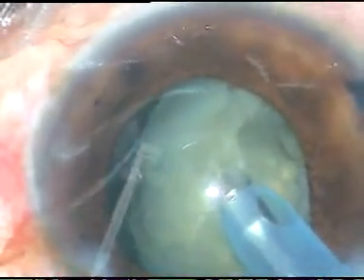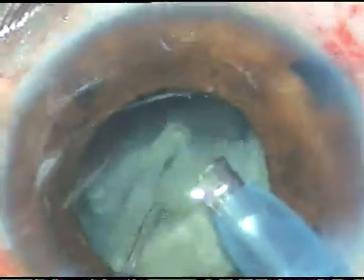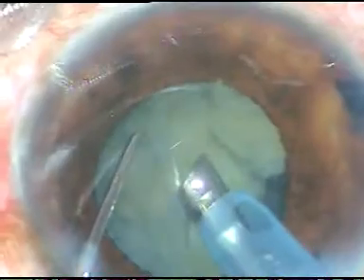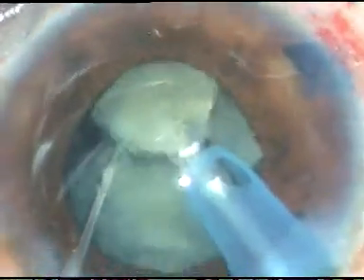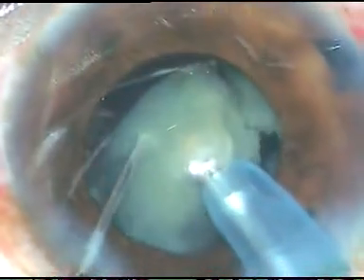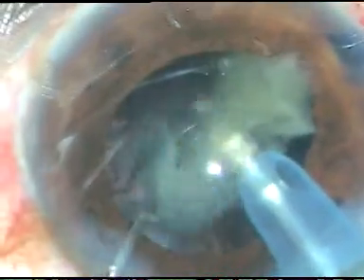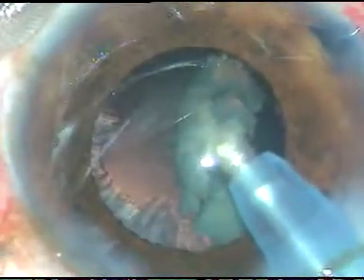This free nuclear fragment is emulsified and removed, but I could not remove it completely. Rotate the nucleus, chop it here again, and this fragment is also partially removed. Since the cataract is not hard, the nucleus is brittle. I am hoping that there will be no problem. I am keeping an eye on the posterior capsule and I can see that there is no rent till now. The case has been done and the posterior capsule is intact.